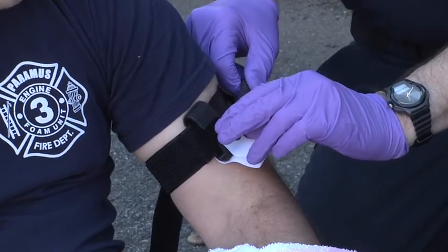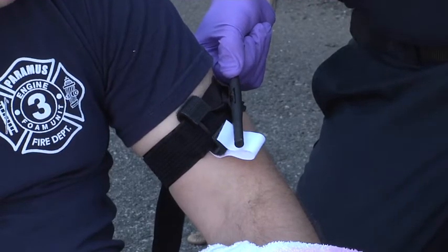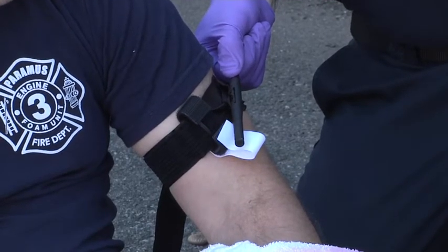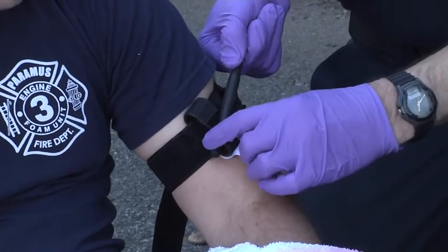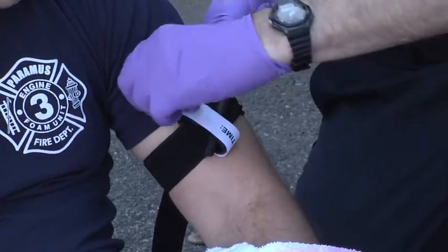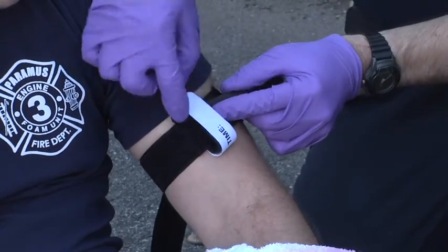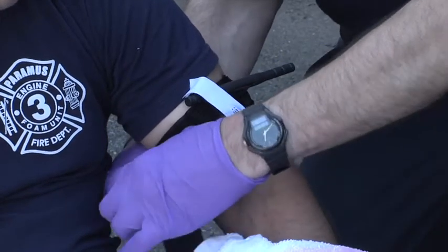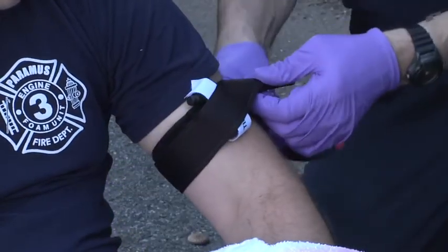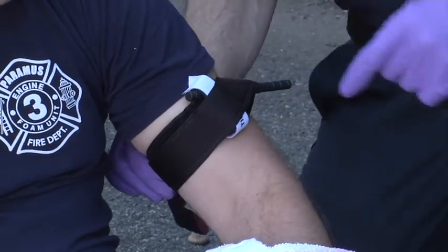Once the tourniquet is tightened to the degree that blood stops flowing and there's no evidence of additional bleeding, you secure the tourniquet windlass inside the holder on top and place the white Velcro on top of it. It's then held in place by the little latch. The rest of the tourniquet can be brought around the arm and secured to prevent the windlass from unraveling itself.